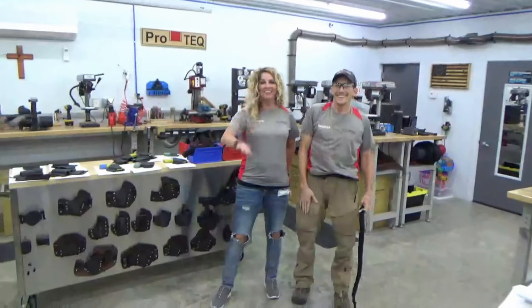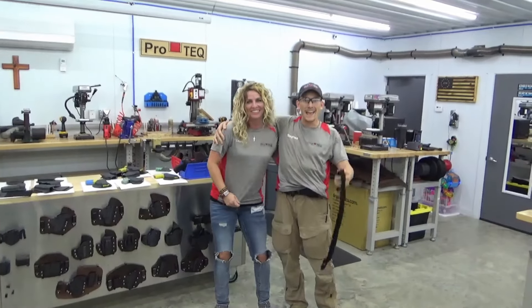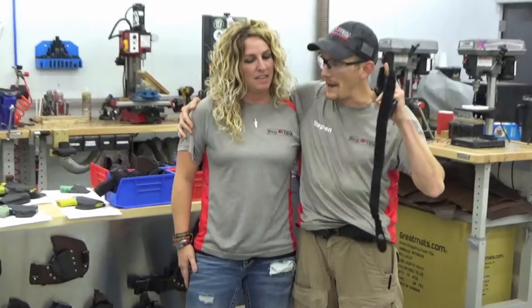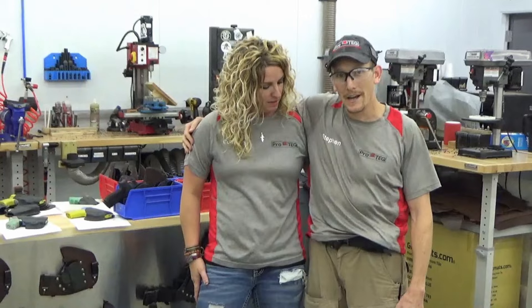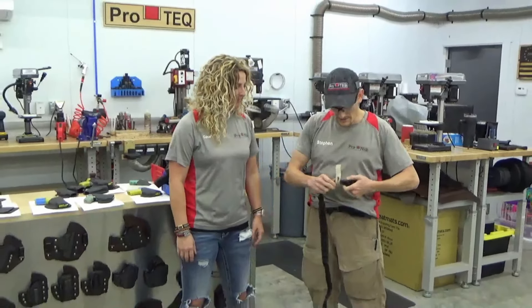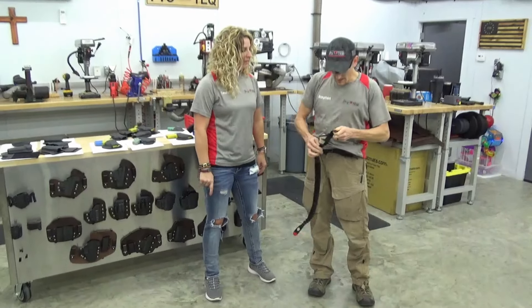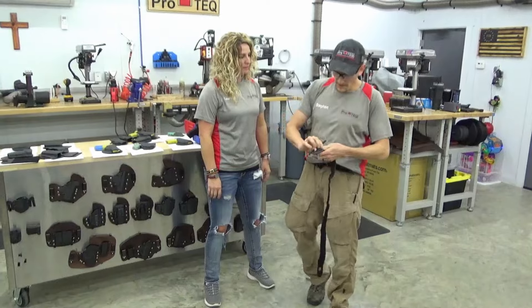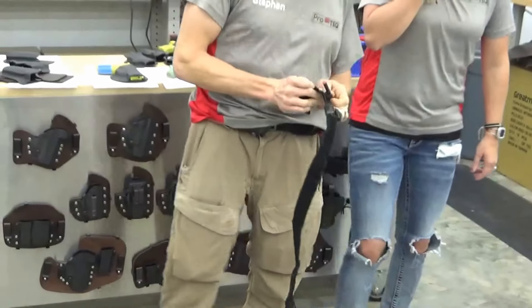Hey guys, welcome to ProTech. Steven and Courtney here. And today we're going to talk about our low profile tourniquet holder. And that's what I used to deploy this tourniquet with in the video today. The low profile tourniquet holder is something that we came up with in the training academy.